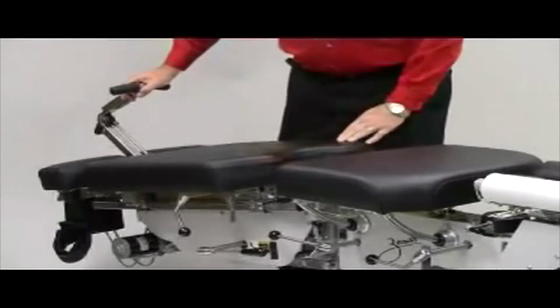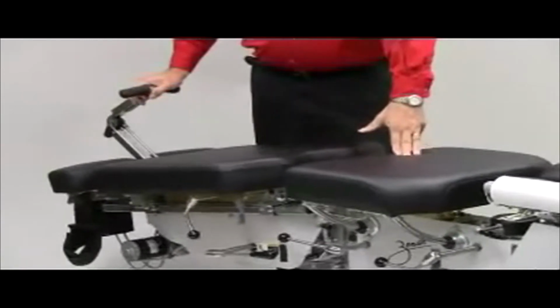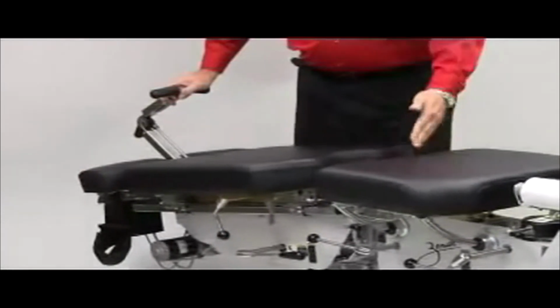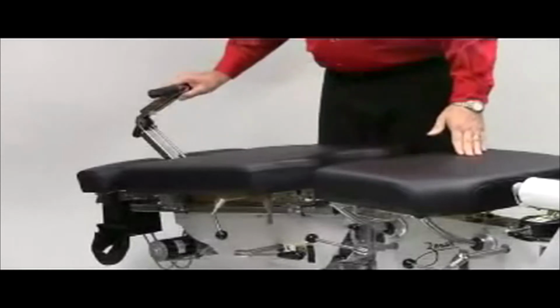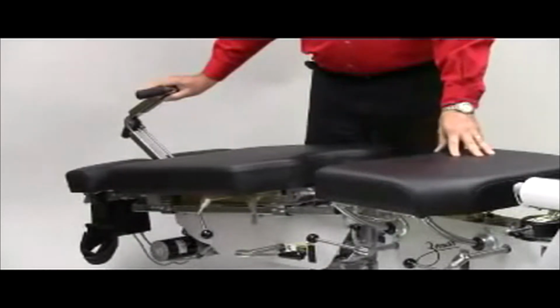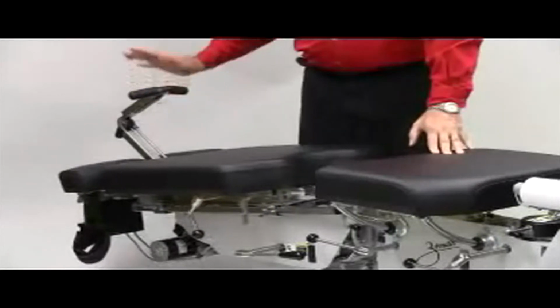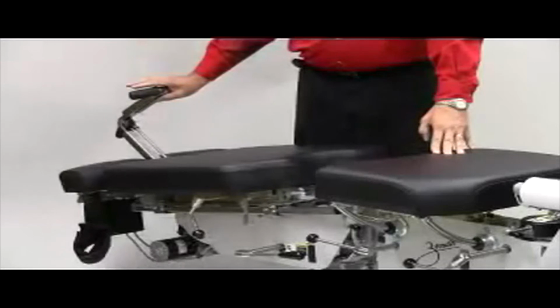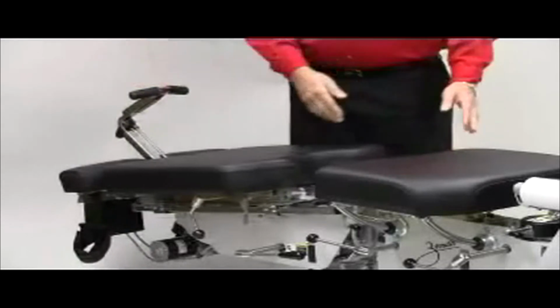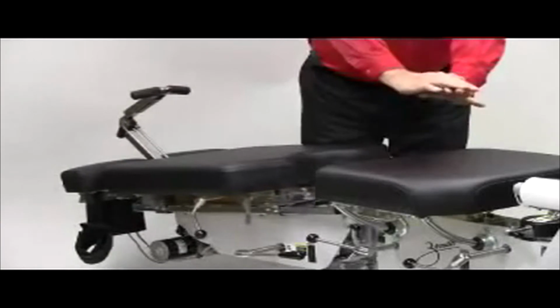The next feature we'll discuss is the automatic axial distraction system, which is great for decompression therapy. The table is on and ready for treatment. It allows for a total of 10 inches of treatment, automatic, and all I'm doing, doctors, is pulsing the button. I also have a foot switch on the floor that I can use to treat the full spine due to the foramen magnum pump.